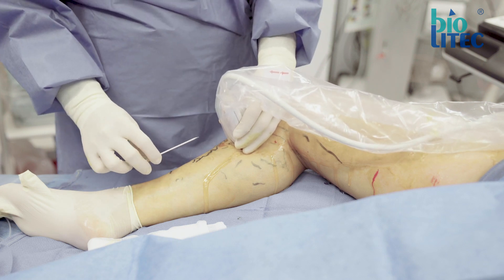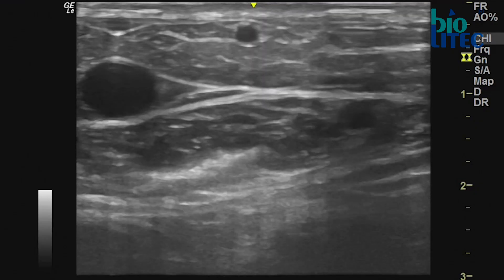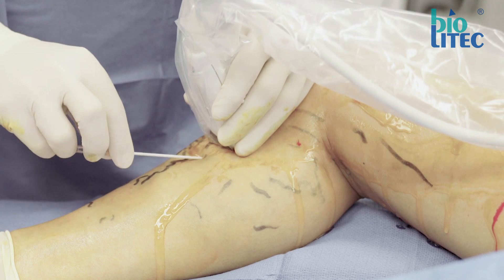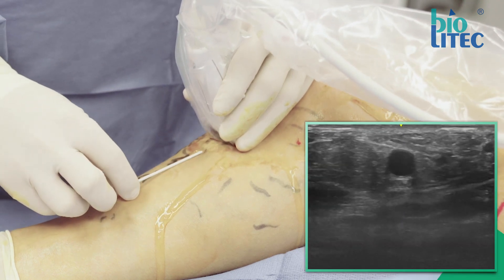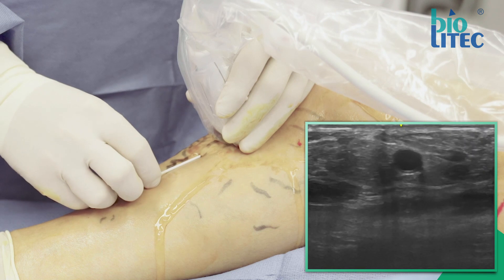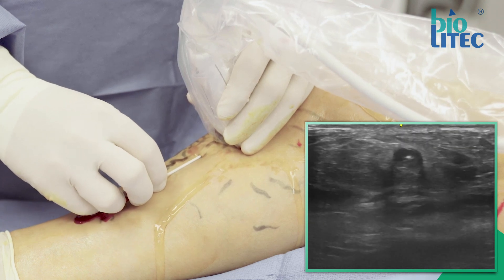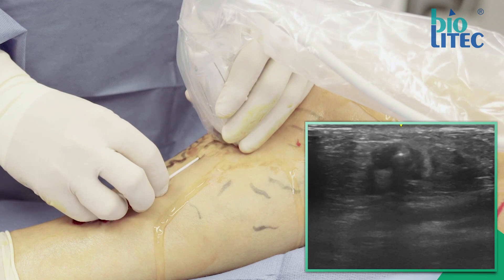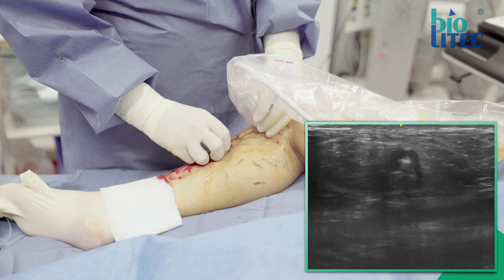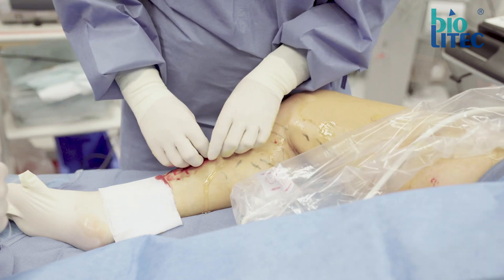Start puncturing at the center of the probe and about 2 cm distal to it. First try to end up just superficial to the vein with the tip of the needle. Never try to force the needle into the correct position — pull back, correct the angle, and try again until you have reached the correct position. Then incline the needle slightly to enter the vein and gently move the needle deeper and deeper, always following the tip of the needle by ultrasound. Finally, remove the needle carefully so as not to cause perforation or hematoma.